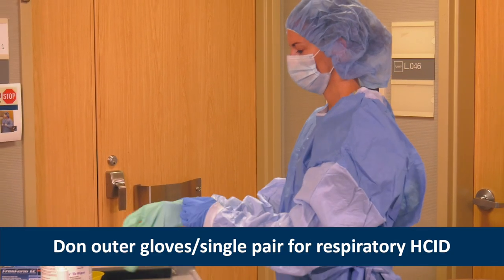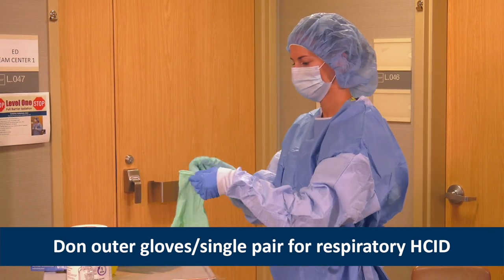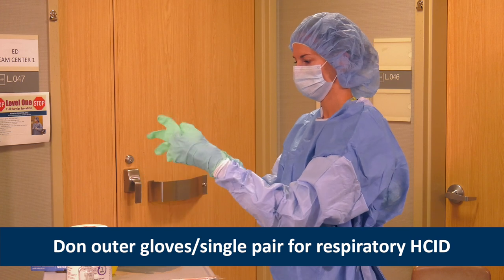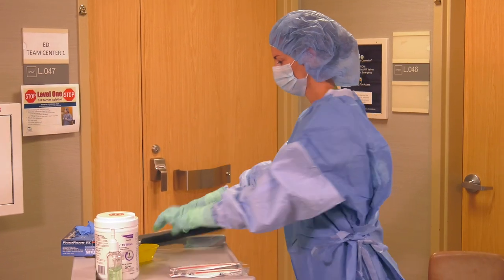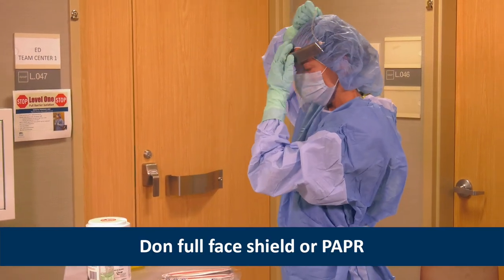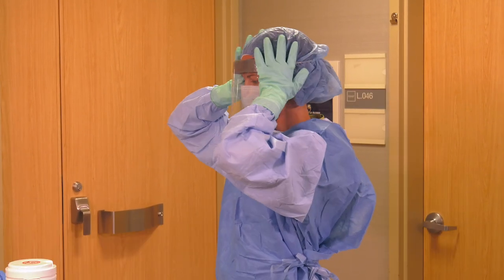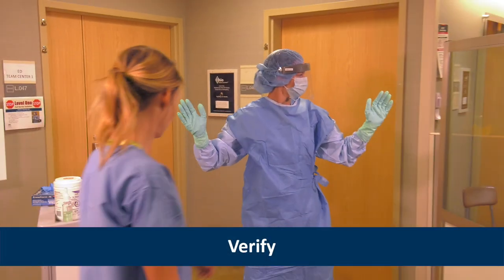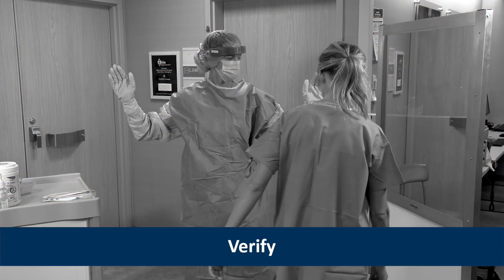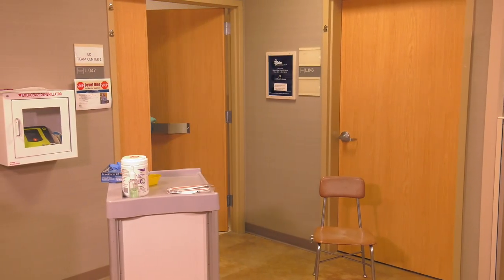She then dons the outer gloves and ensures the extended cuffs are pulled over the gown sleeves. This is where you would put on a single pair of extended cuff gloves for a respiratory HCID. Next, Heather puts on a full face shield over the hair cover and surgical mask or N95 respirator. This is where a PAPR with an integrated face shield would be donned. Heather asks Angie to help verify the integrity of the PPE ensemble, making sure she is comfortable and able to go through a range of motion while remaining correctly covered. Heather is ready to enter the Level 1 Full Barrier Isolation Room.